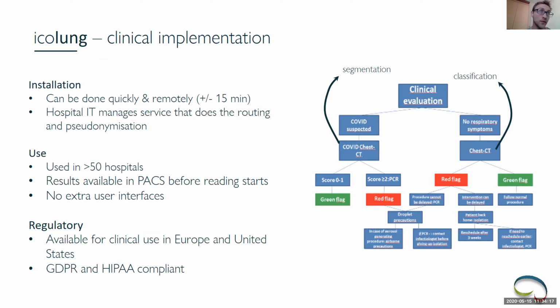And this is done in what is called a pseudonymized form. That means that in the images, there is no patient-identifiable information anymore in the cloud, but there is the possibility to re-identify that particular scan. Of course, this is needed, otherwise the results cannot be used in a clinical routine setting.